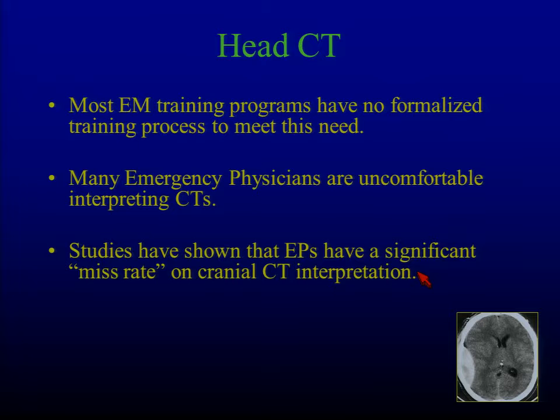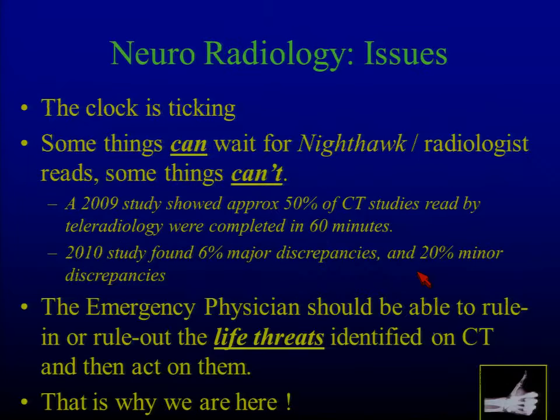If you look at studies, emergency physicians sort of globally are uncomfortable reading head CTs, or at least traditionally have been. And there's maybe 6 or 8 studies out there, and we don't have a great track record. If you do a test on emergency physicians for looking at head CTs, obviously the more subtle the finding, the harder it is to identify. But there's literature out there that says we're not great at it.